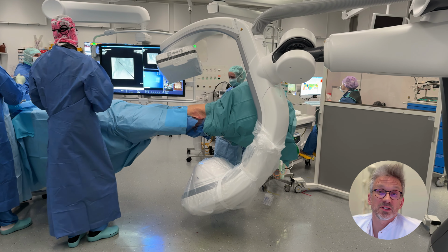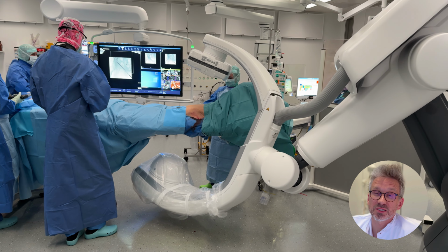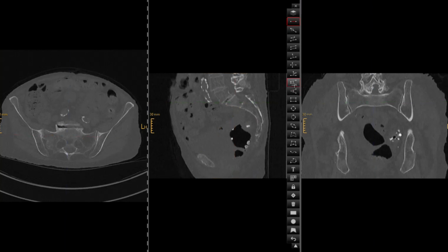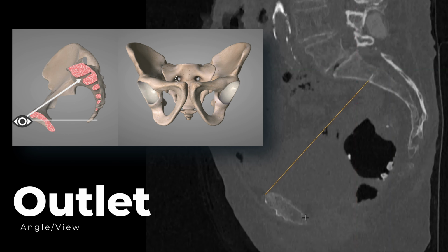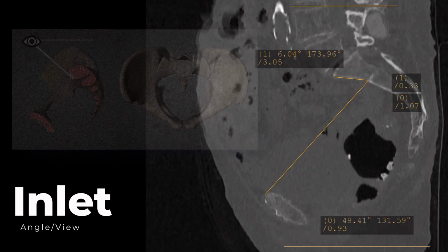The 3D robot-assisted imaging-guided navigation system enables swift switching between personalized inlet and outlet views, allowing for best imaging quality to prevent suboptimal screw placement. Personalized angles are measured on the diagnostic CT scan. The outlet angle displays the paracoronal surface of the sacrum without symphysis superposition, guiding the craniocaudal direction of the screws. The inlet angle provides perfect visualization of the anterior cortex and the anterior-posterior screw orientation.